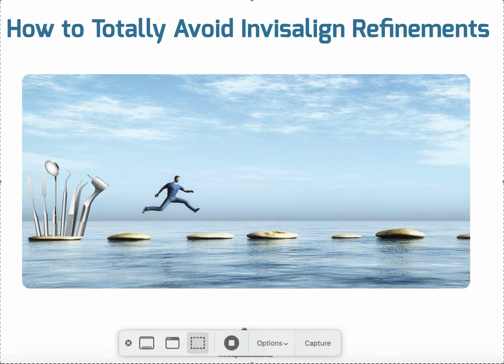Sometimes, maybe less than 30% of the time, I'm okay with it. I almost always increase the number of aligners by 50, 60, 70, 80, 100%, double them. With ClearCorrect, sometimes I triple them, sometimes I quadruple them. It's just like, there's no way. Remember, we're orthodontists, so orthodontists tend to have a way lower revision refinement rate than general dentists who do Invisalign or ClearCorrect. We know what's predictable, we know what looks right. We look at something and we call BS on it if it's not possible. I don't want my revision refinement rate to be 80%. I want it to be 0.